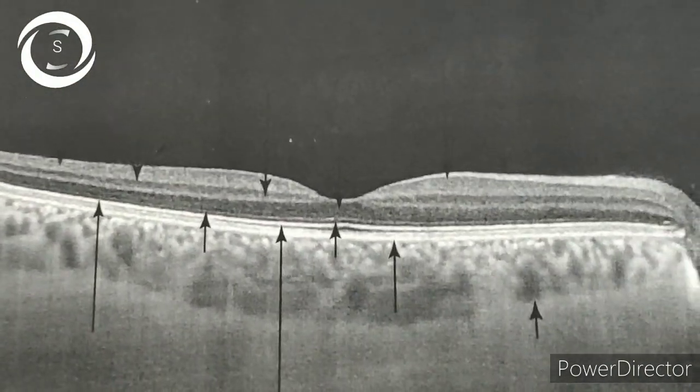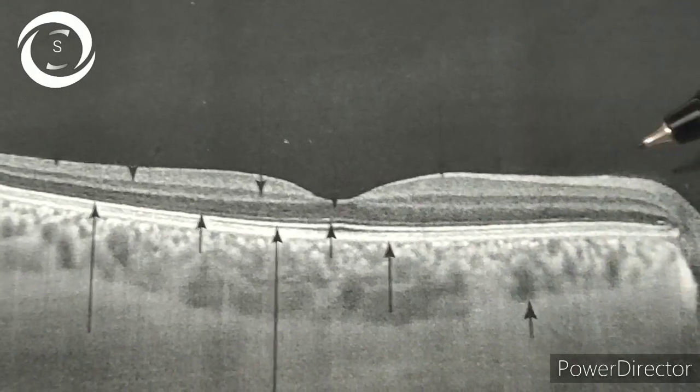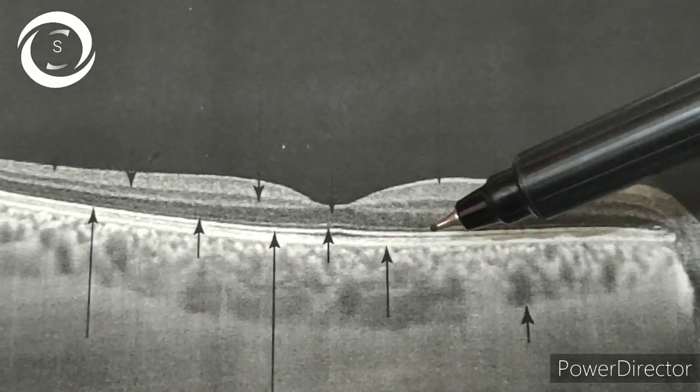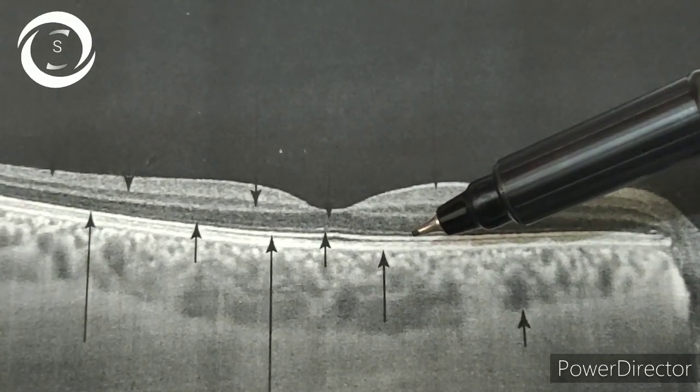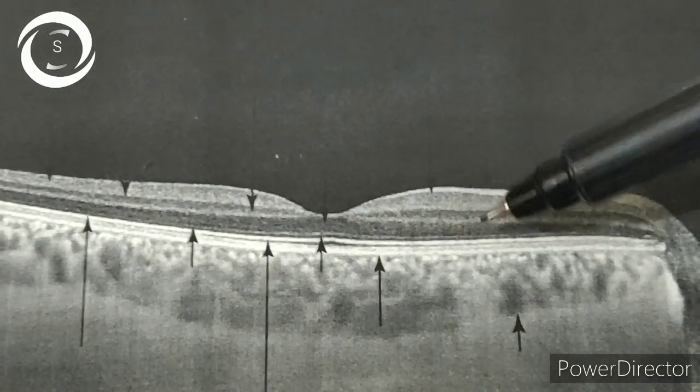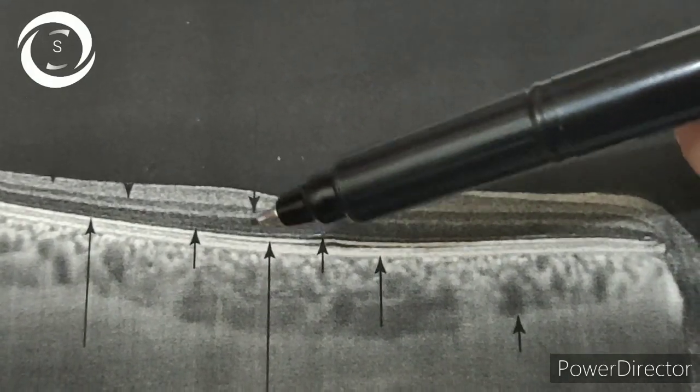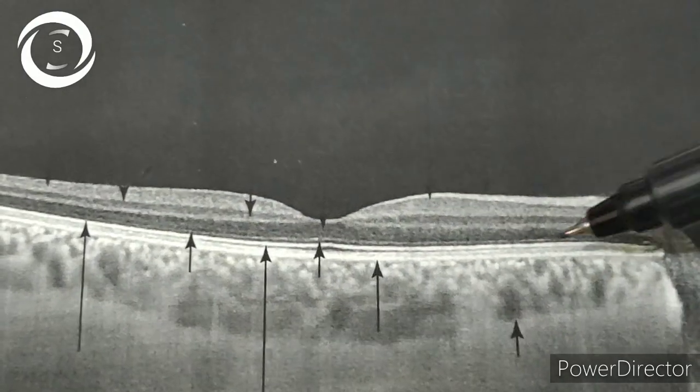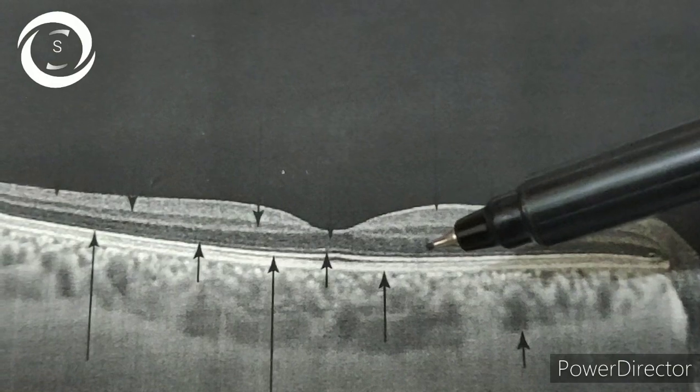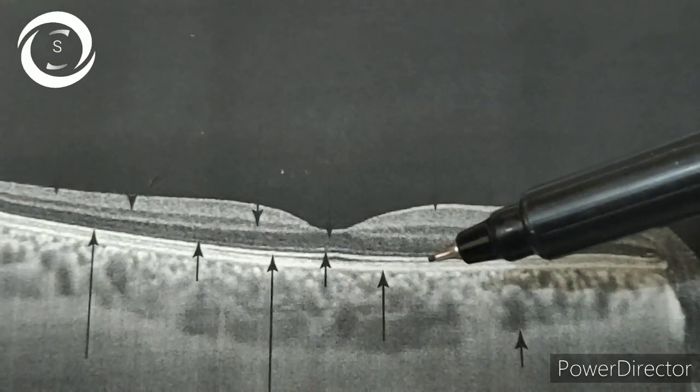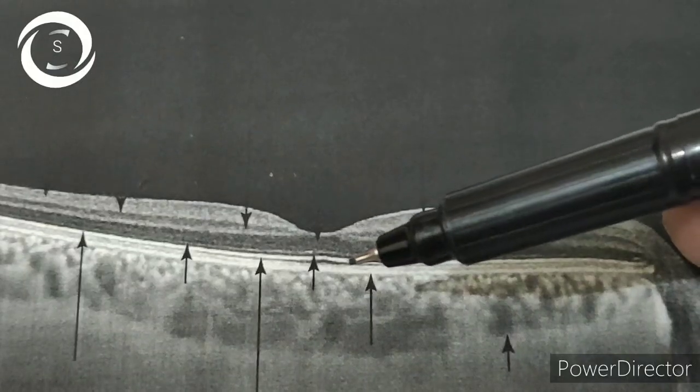We have zoomed it now. That thin line is the external limiting membrane. Below it is hyporeflective myoid zone consisting of inner segments of the photoreceptors. Beneath it is hyper-reflective line which depicts the most sensitive IS/OS junction, inner segment-outer segment junction, or ellipsoid zone. Stretching of it for long can cause profound visual loss.